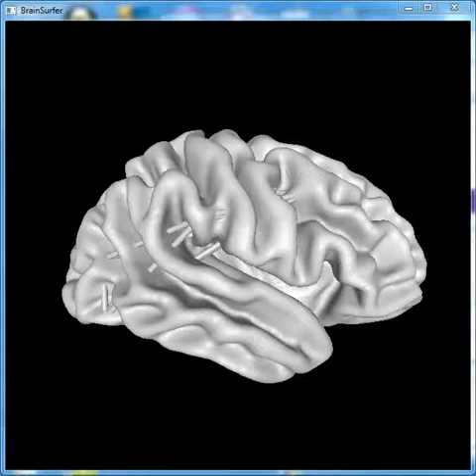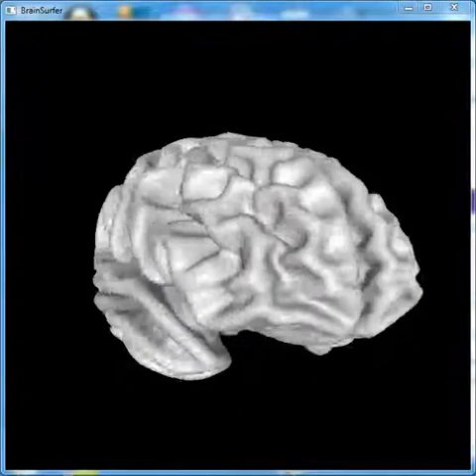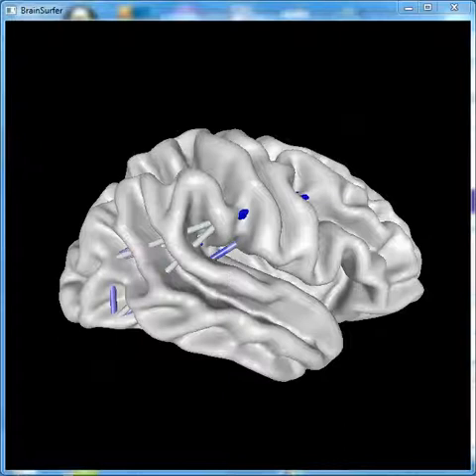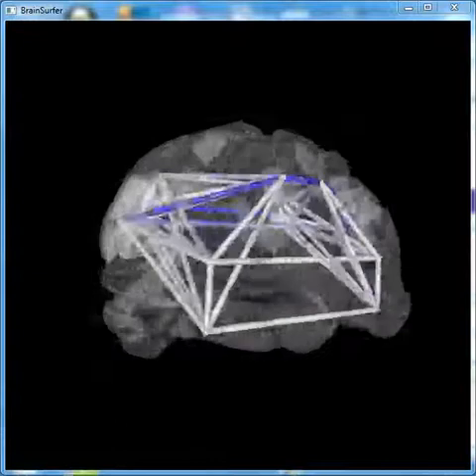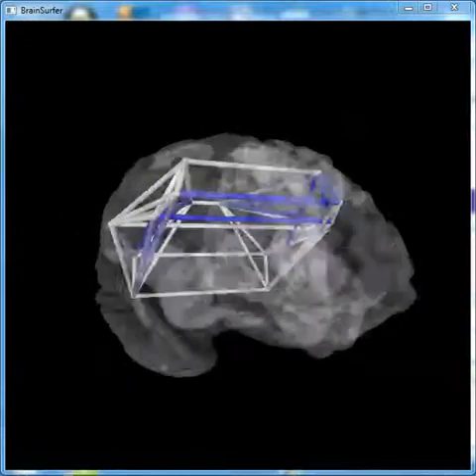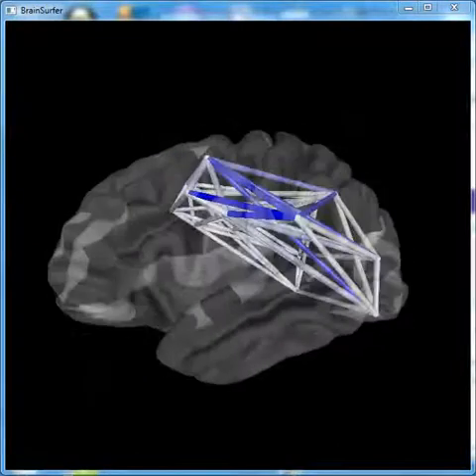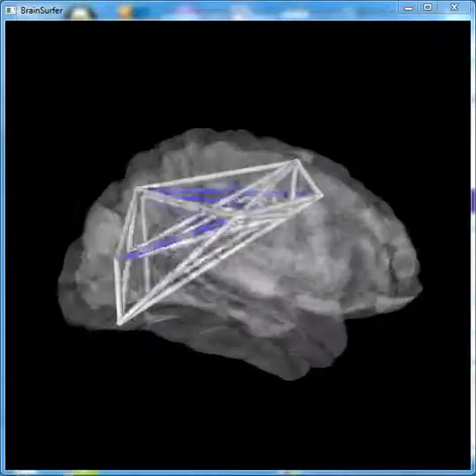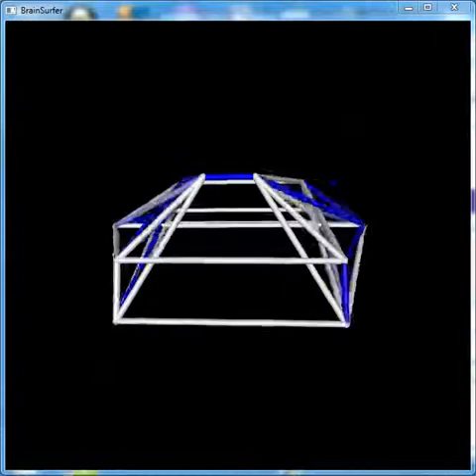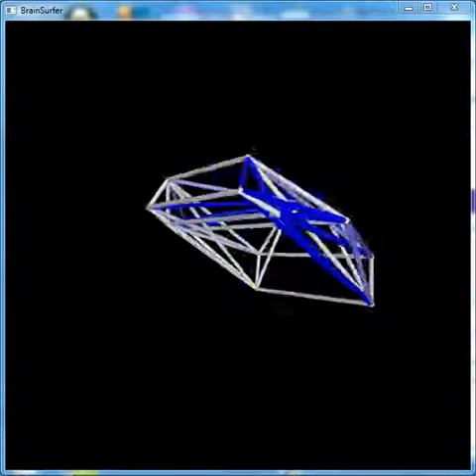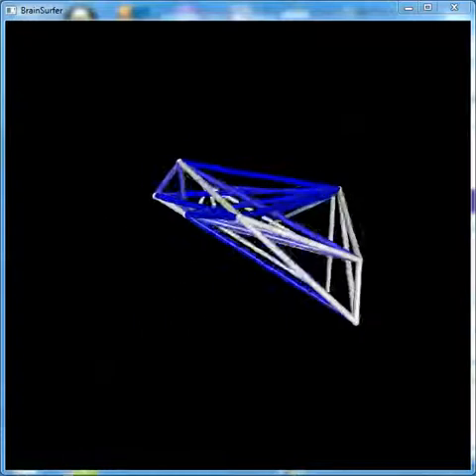We've now activated them. I'm going to rotate it so you can see the attention network from the completely rendered brain before we make the brain more transparent and evaluate the dorsal attention network. The brain can be zoomed in, zoomed out, rotated up and down — you can look at the brain from underneath or on top. In this case, I'm going to make the attention network even more visible by making the brain more transparent, in which one can do biofeedback on this particular network by instructing patients to make the network white, which would be the state of maximum stability of the attention network.